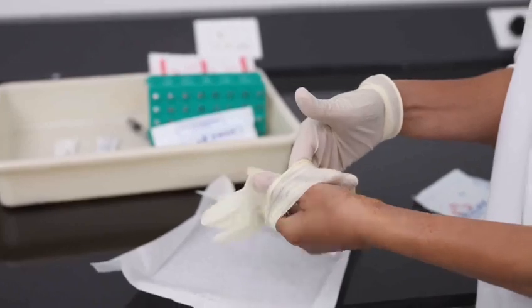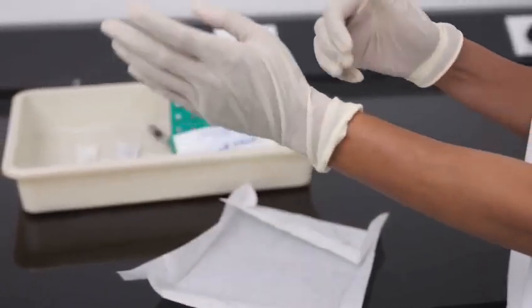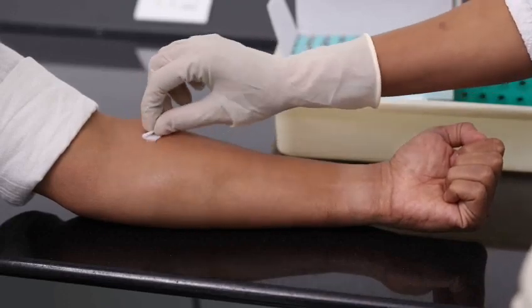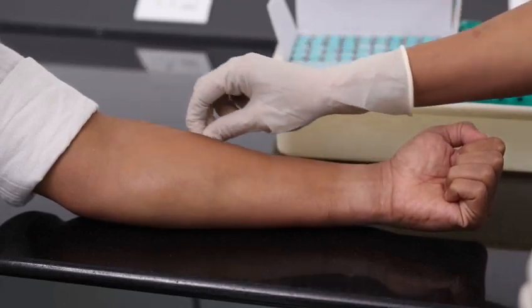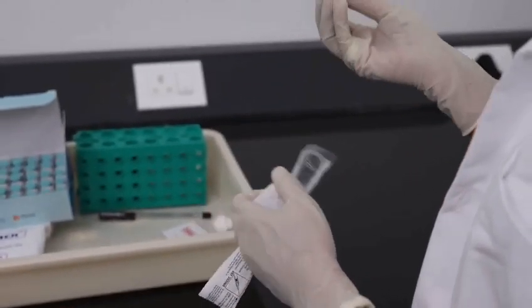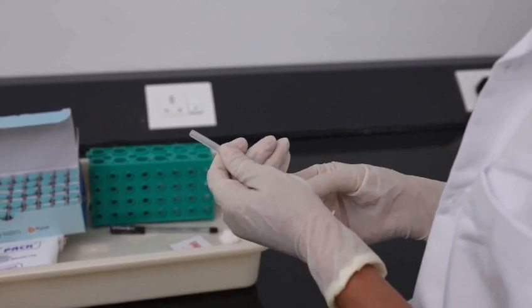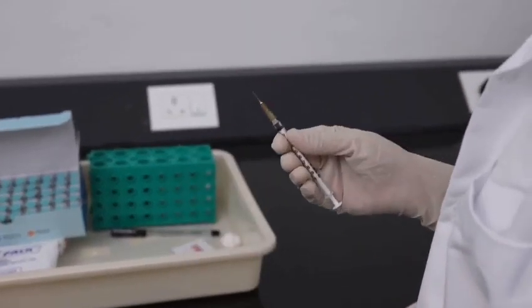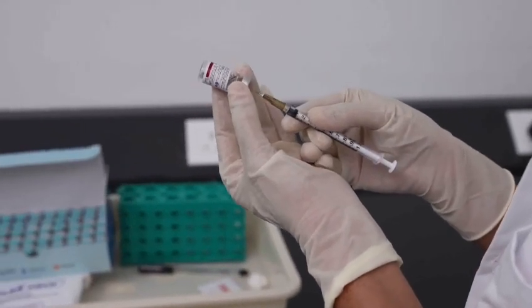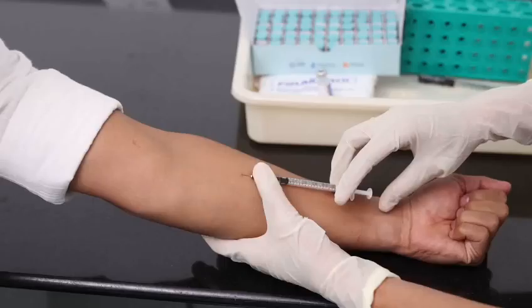The skin test for TB is to be given on the volar surface of the forearm. Cleanse the area with alcohol swab and allow the area to dry. SciTB is administered by injecting 0.1 ml of SciTB solution intradermally. The solution should be injected using a 26 gauge needle with a 1 ml syringe with the needle's bevel facing upwards. Hold syringe flange parallel to the forearm.